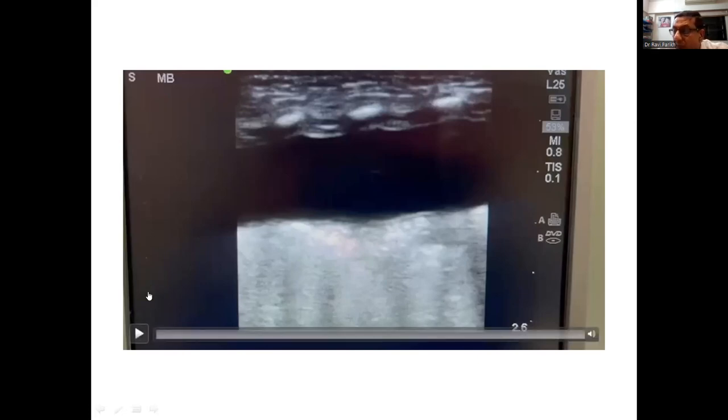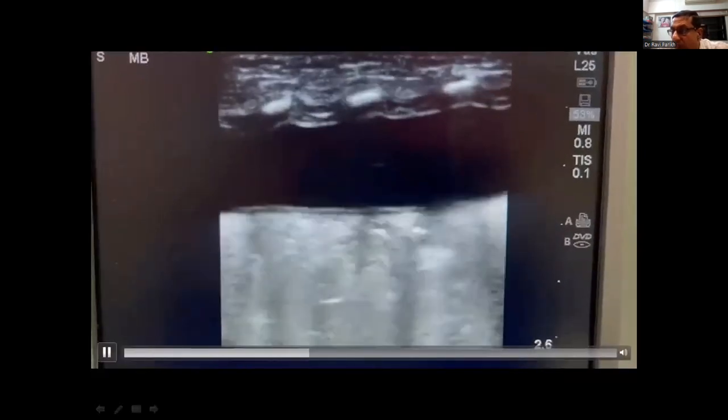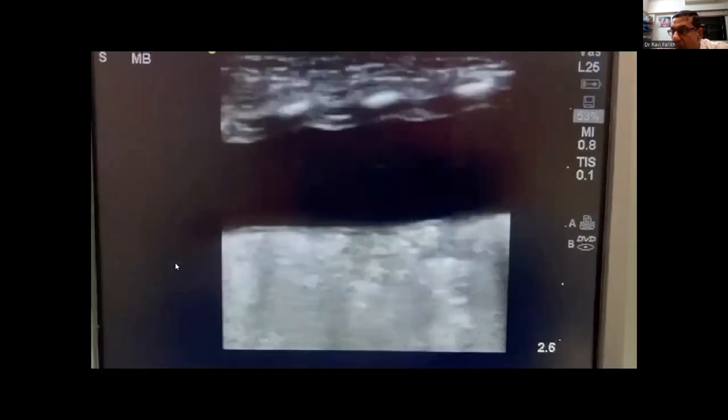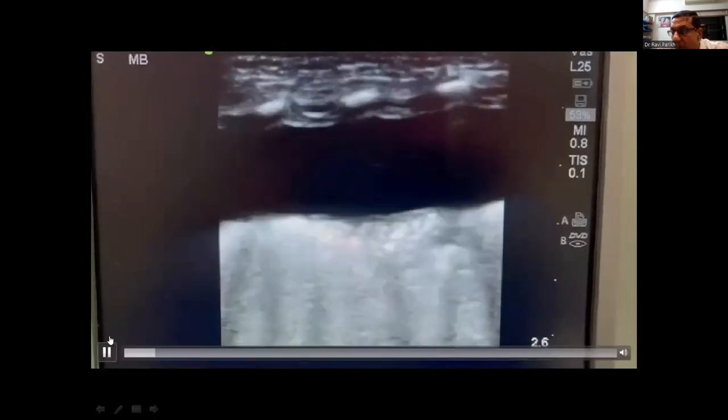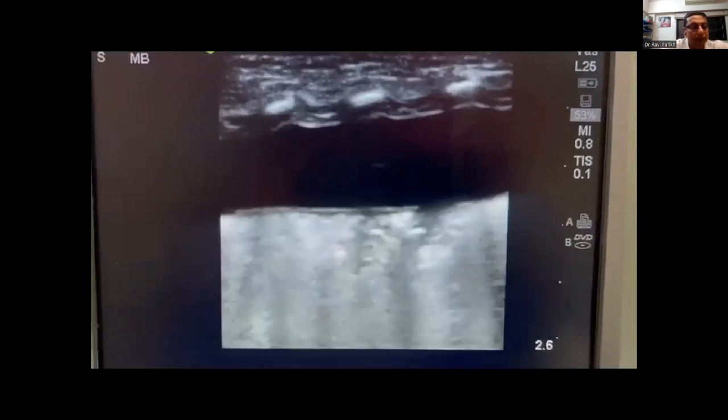Again, my feeling is this is probably an anterior scan because I can't see the spine either. I can't see spine sign. So I think your probe is anterior, but it's basically showing compressive atelectasis. And the fact that you've drained and it's become an A profile then means that actually there's no primary pathology in the lung. This is predominantly fluid causing atelectasis.